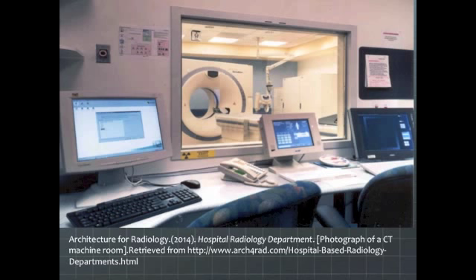So that's getting rid of film. It's done on a computer screen. And that's about when PACS came in, you had to have somewhere to put those images from the computer screen. But it wasn't a full-blown PACS like we have today.